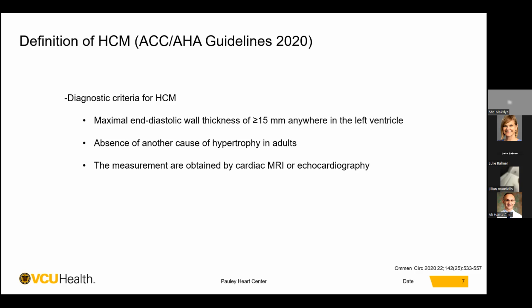Cardiac CT can also be used to obtain these measurements. However, it's not a common practice as this may require contrast and radiation, and more radiation. We have to do it in a retrospective fashion. Add to that the poor temporal resolution of CT compared to other modalities, but it can be done.